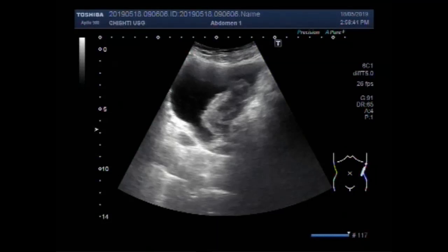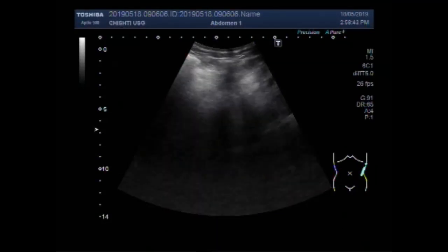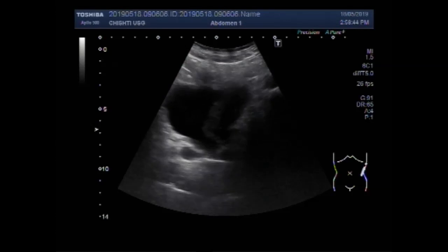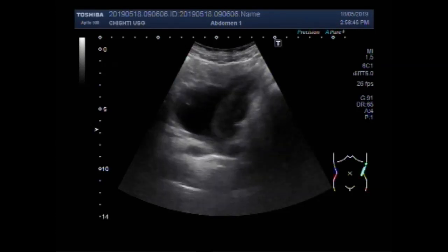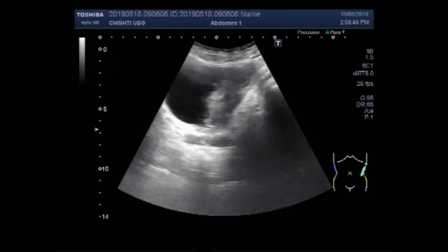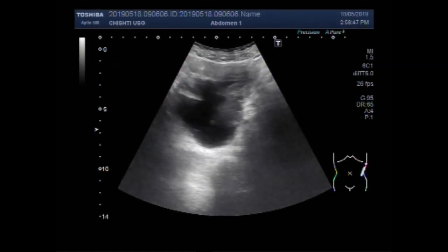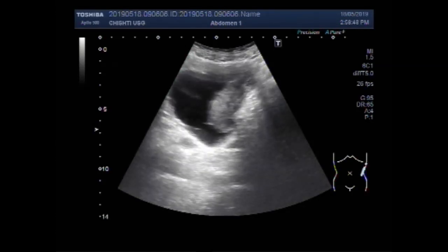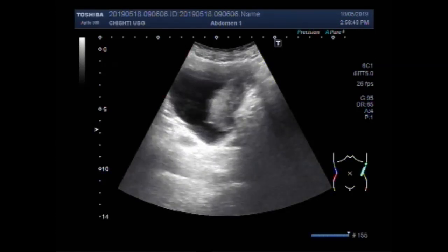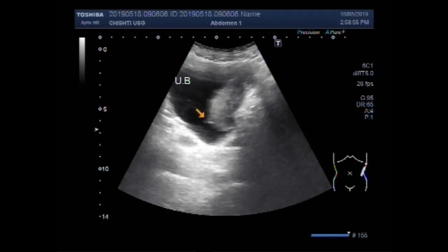Dear viewers, I hope you are all fine. This ultrasound video shows a vesicle mass, a mass in the urinary bladder. You can see this is the urinary bladder and this is the mass.